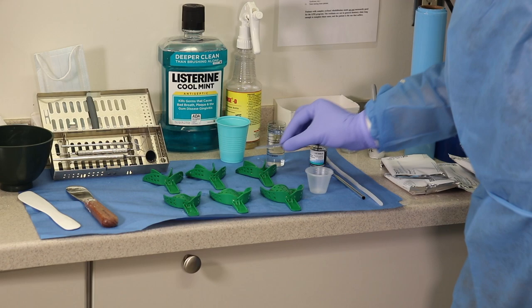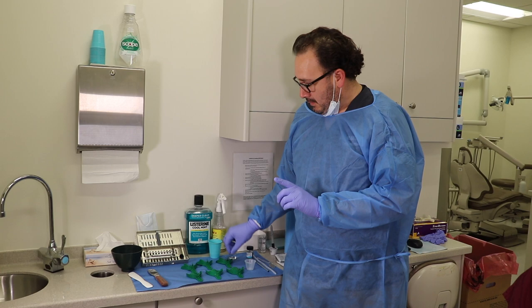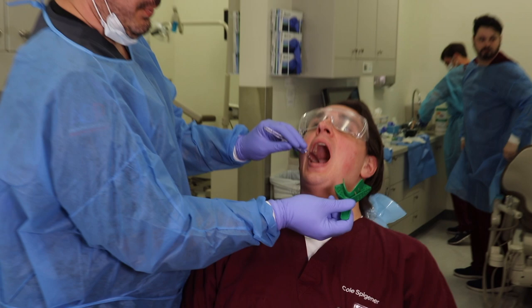When we talk about trays, we have the plastic trays like the ones we're using here, or we have metal trays as well. We decided to use large plastic trays in this case, and I'm just going to try it in. I'm going to try in the lower one first.